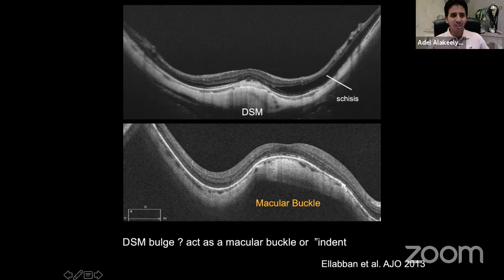I got a question about your recent article on foveal lucency, which I think you described with the work you did with Dr. Salam, if I'm not mistaken. This is a new condition; to me at least, I've never heard about it. Is this something that is a predictor for the vision overall, or is it significant in terms of the anatomical closure of those holes?